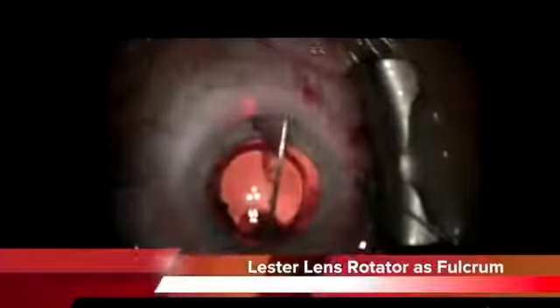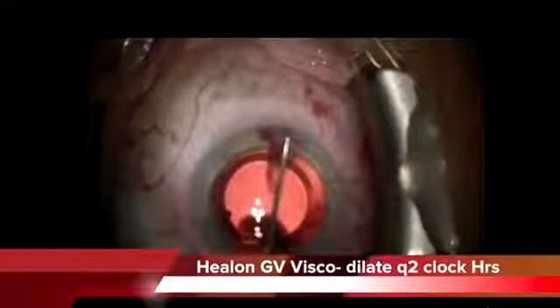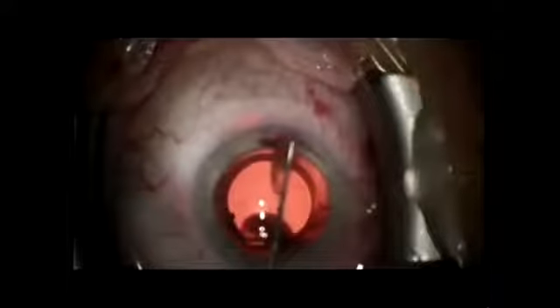Now it's important that the catheter have been primed before we entered the eye, and also very importantly at this point we want to reprime the catheter with several clicks until we see some Healon oozing from the tip before we begin to pull it back. Here I have inserted a Lester lens rotator and am holding it up against the catheter so as to help act as a fulcrum to avoid traumatizing the canal. Every 2 clock hours my nurse turns the dial on the Healon, so we introduce Healon every 2 clock hours as we are smoothly withdrawing the microcatheter. The microcatheter is removed.